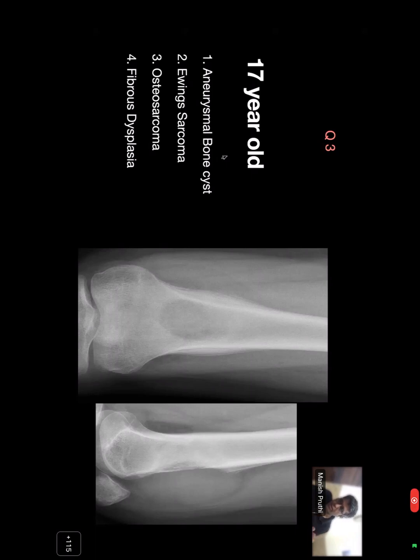So one thing we are sure of is that it is a primary malignant bone tumor. And now the last discriminator, which is the matrix of the lesion: we can't see any matrix here. So a primary malignant tumor which has no matrix is Ewing's. Fine. So periosteal reaction will guide you between benign and malignant, but don't make your diagnosis on the type of periosteal reaction and the histology. So it is a primary malignant bone tumor based on the radiological features, and no matrix classifies it as an Ewing's. If I know the radiology, then seeing the slide becomes very easy, because I know what I'm going to look for in Ewing's, and I think we should be able to make a diagnosis here.